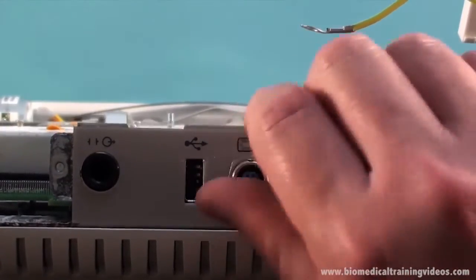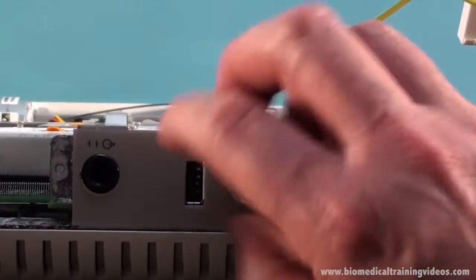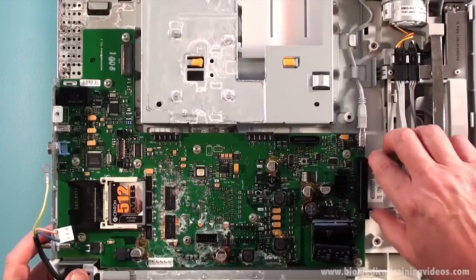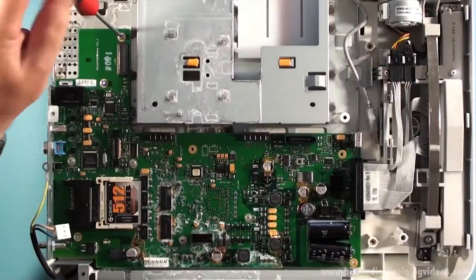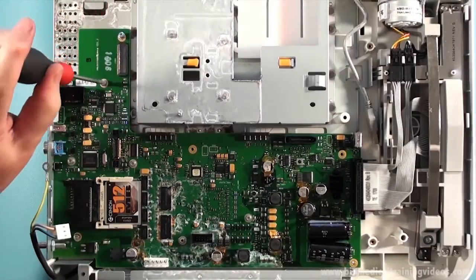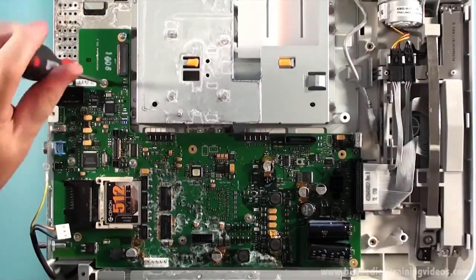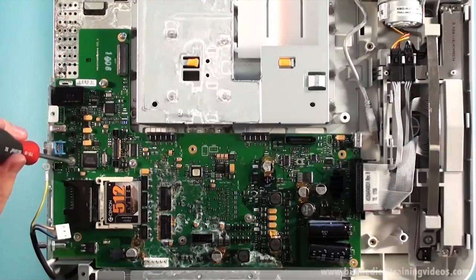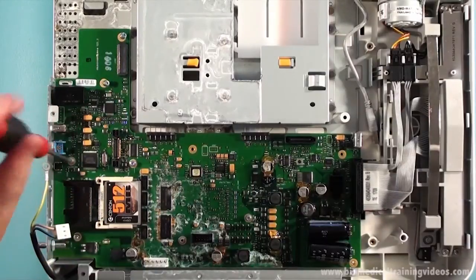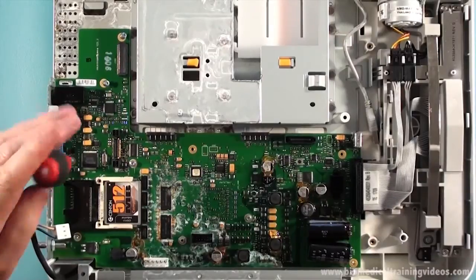Just undoing the nut on the patient input module socket. Quite a few more screws securing this main board in position. As you can see there is quite a bit of damage in the center of the board from that water I spoke about earlier. This whole unit was pretty well a write off.